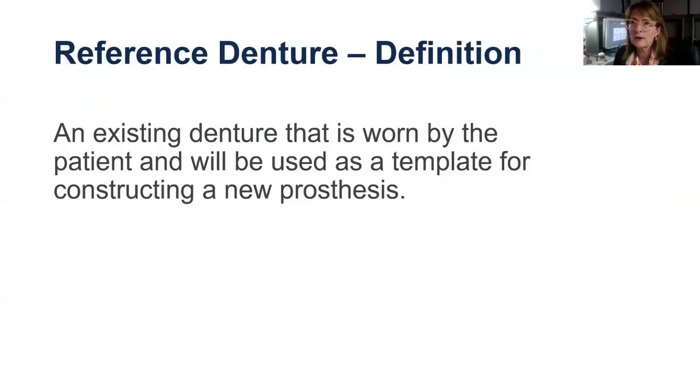So let's shift into the reference denture. The reference denture is by far what we do the most of, what we're finding the greatest success with. So much so, and part of me doesn't like to speak it out loud, but I like to share that this is an evolution, right? 18 months ago, 2 years ago, we weren't even really scanning for dentures because the software wasn't quite where it needed to be to be able to turn AI on and off and to be able to accurately acquire the data.